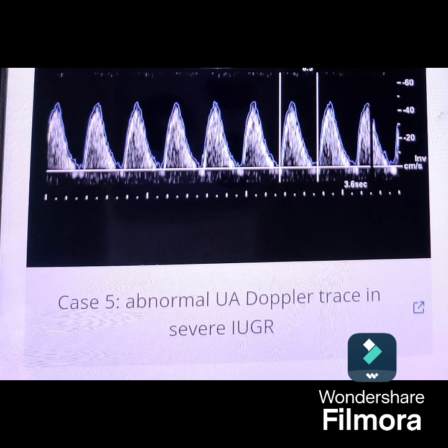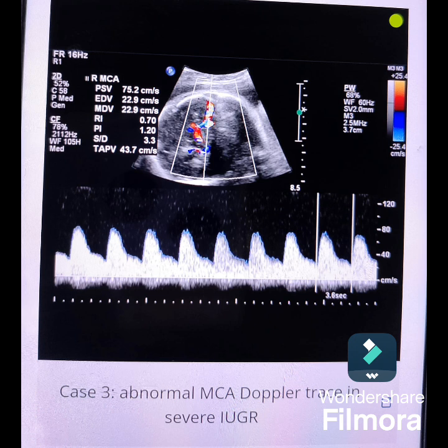So what is the flow chart or algorithm? For example, the uterine artery Doppler is done at 12 weeks and shows an early diastolic notch and absent or less end diastolic flow, then it is repeated at 23 weeks.